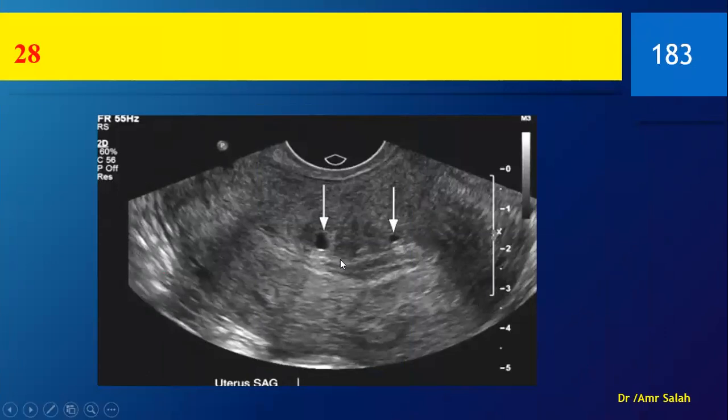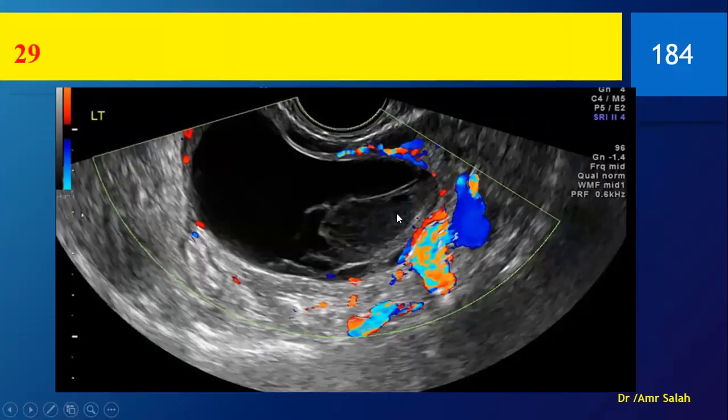See the cystic spaces, the subendometrial cysts. This is an adenomyosis. What about this? This is a cyst in the ovary. It has this soft tissue shadow inside, but there is no vascular flow inside. So this is a tumor? No. As there is no vascular flow in this part, it will be considered a clot, and this is a hemorrhagic cyst, so long as there is no vascular flow inside.